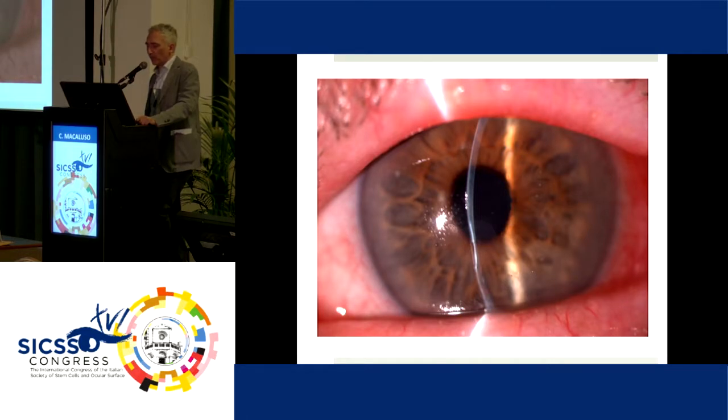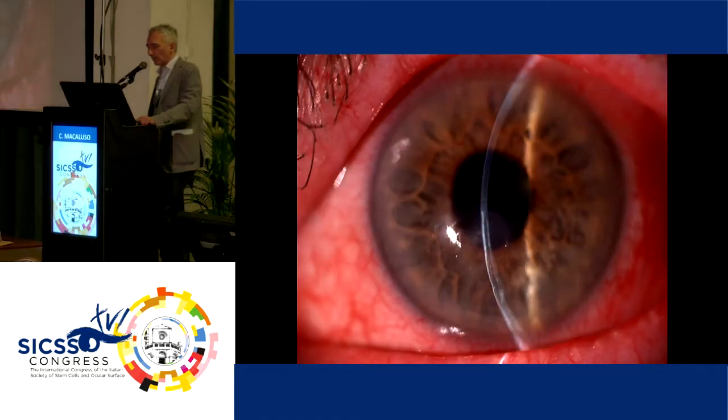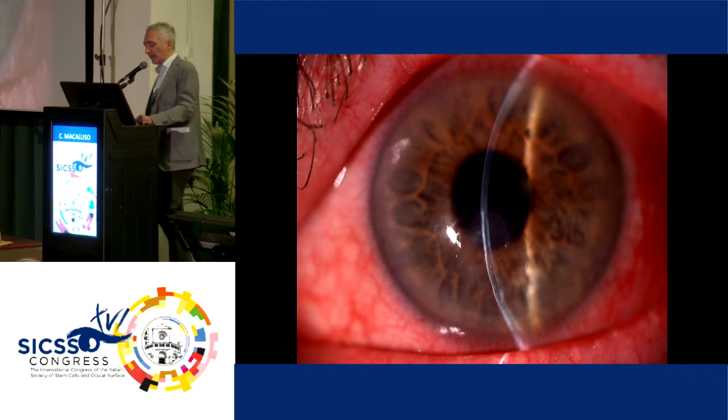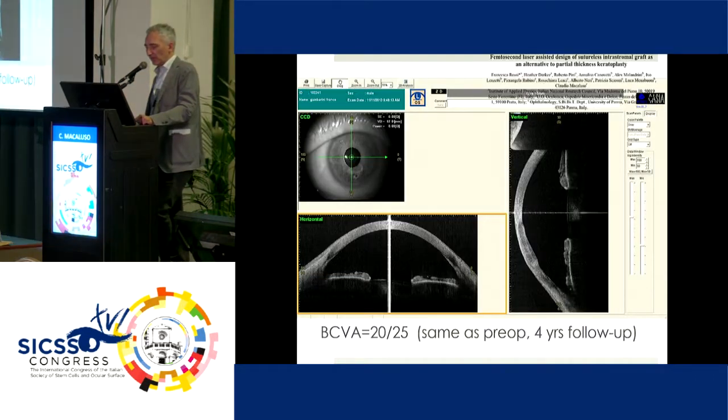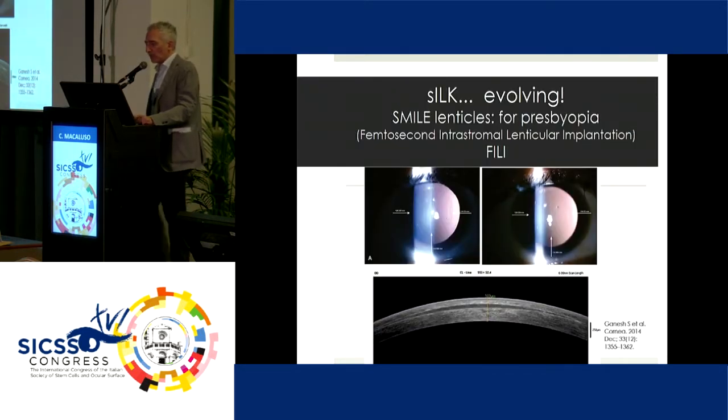This is a case dating back to a few years ago. Here you may see superficial erosions. So we wondered why not repair it from the inside and make a small flap to be introduced through a pocket, and in this way reconstruct the eye structure. And that's what we've done. So we've used a femtolaser to bevel some of the angles. And this is the situation after some years, a good functional and visual recovery, and the invasiveness was really minimal.